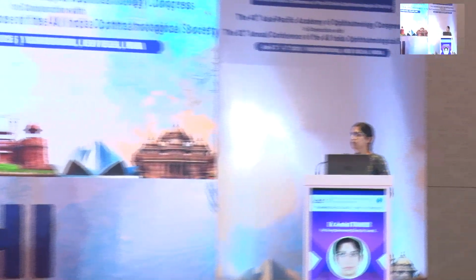Dr. Anchal, could you explain a little bit again how the depth of focus, how you would use that, once you've done cataract surgery for one eye, then how do you do it for the other eye now? Yeah, actually the depth of focus is another way to plan monovision or a mini monovision. So once we plan a cataract surgery, we operate the dominant eye first, and we try to achieve maybe plano or maybe a slight minus.